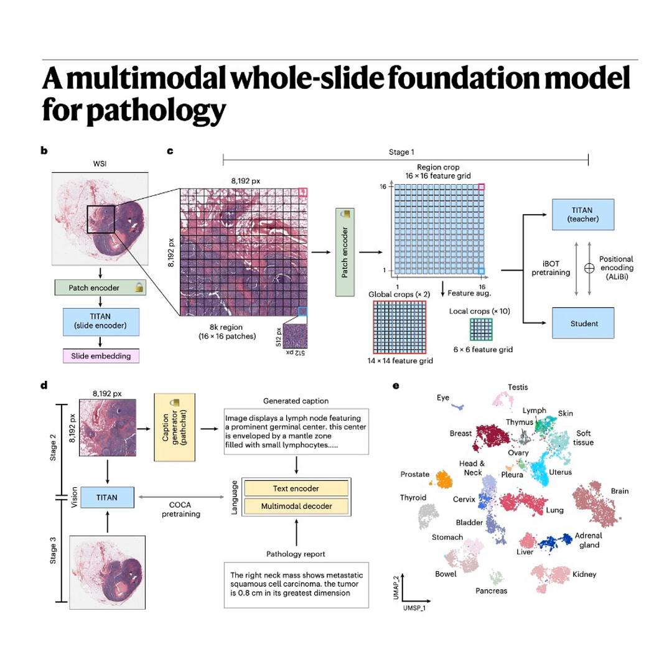Okay, now what about the unique things you can do with the language component, this cross-modal functionality? Can Titan actually diagnose using only text? Yes, this is zero-shot classification. So a pathologist can input an entire slide and then just type a diagnostic question, a text prompt like, identify the subtype from this list, without the model ever being specifically fine-tuned for that task. It's just using its pre-learned connection between vision and language. Exactly. And the results here were game-changing.